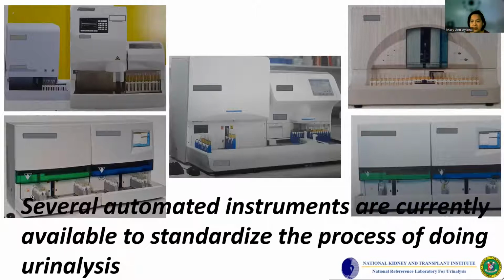The quality of your result may also improve since samples can be processed more efficiently and therefore closer to their collection time, decreasing the likelihood of cell lysis, microbial contamination, or precipitation from prolonged storage. Labs utilizing automated urinalysis note that producing digital reports is less time-consuming and less prone to clerical errors.